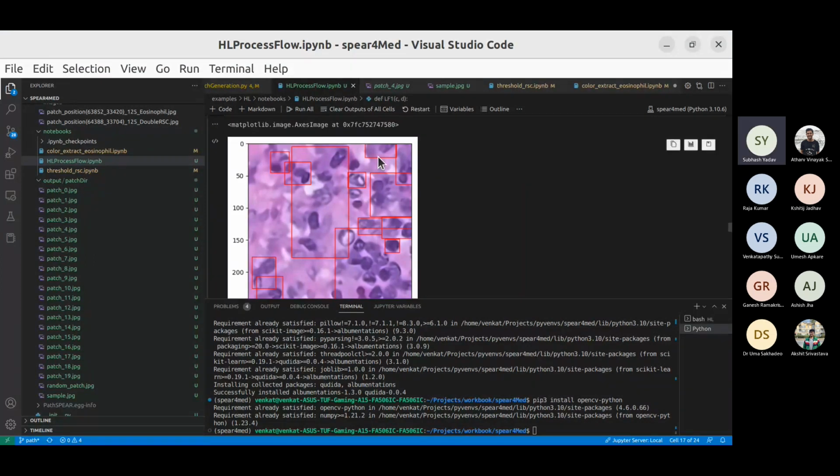So the results which you showed look nice. They are quite impressive, but we need to refine them. Of course, yes, we will refine them more because there are some outliers that I can see in the images.